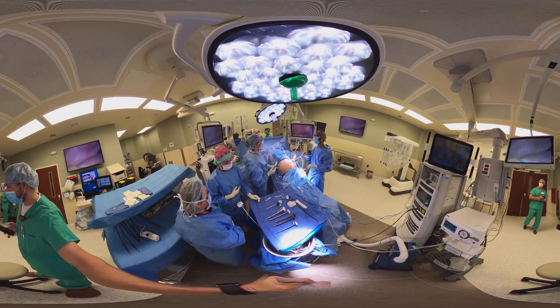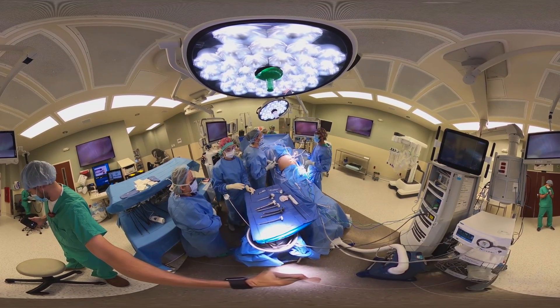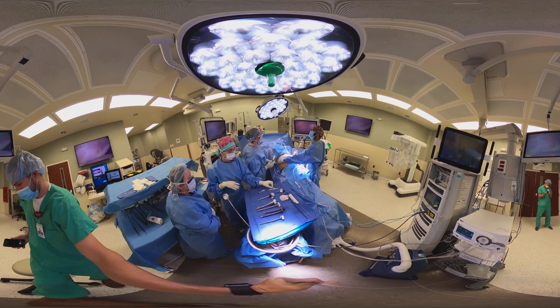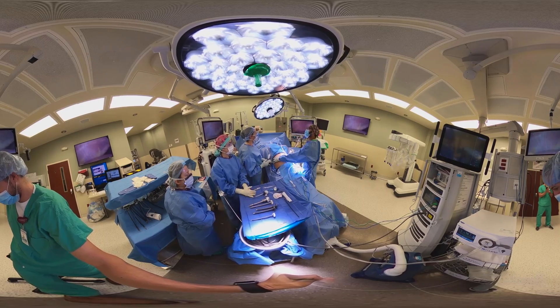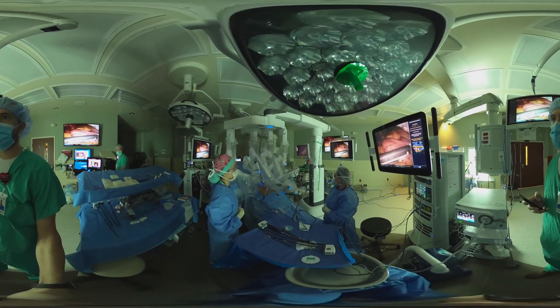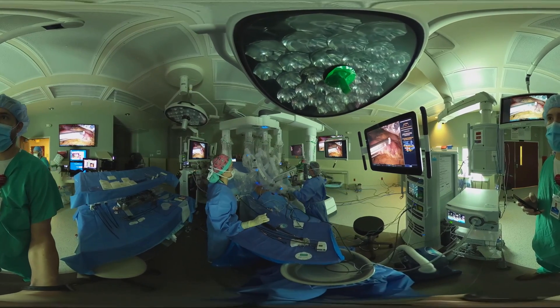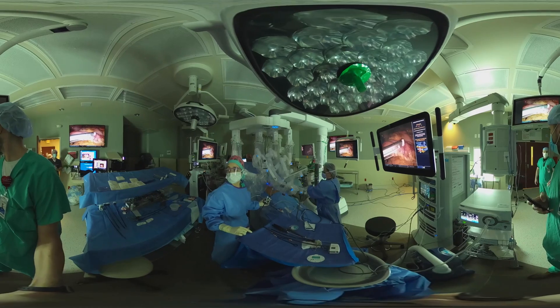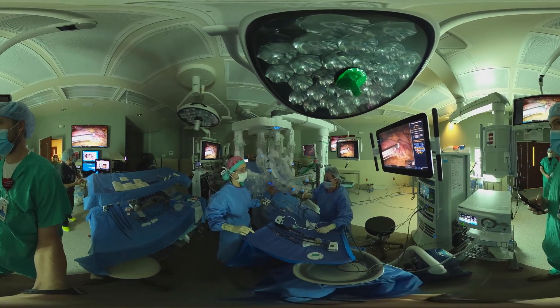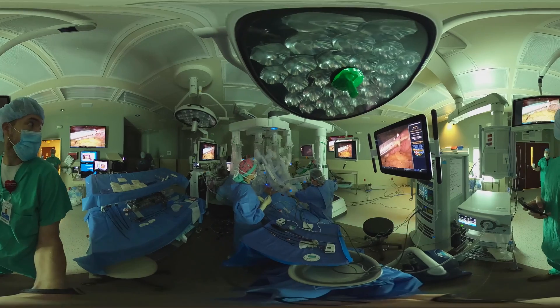The first thing we do as we're placing in our instruments is perform a bilateral TAP block. This is a procedure that injects long-acting local anesthetic into the abdominal wall, and it's going to allow for post-operative comfort and pain control. It has really helped us decrease how many narcotics our patients need after surgery, to the point that most of our patients may need only three or maybe four doses of narcotics after surgery.